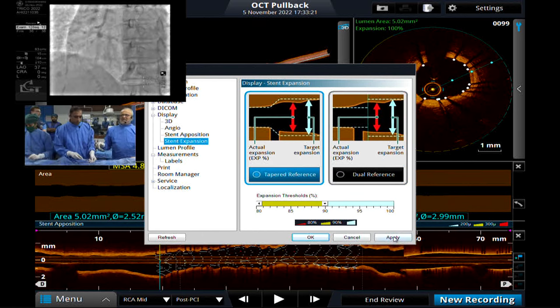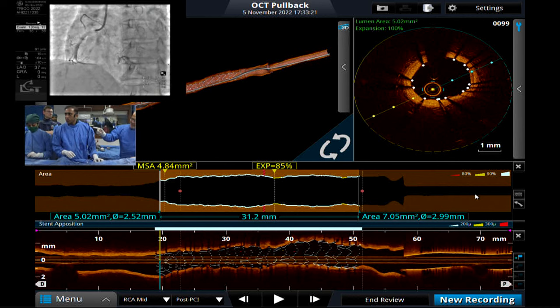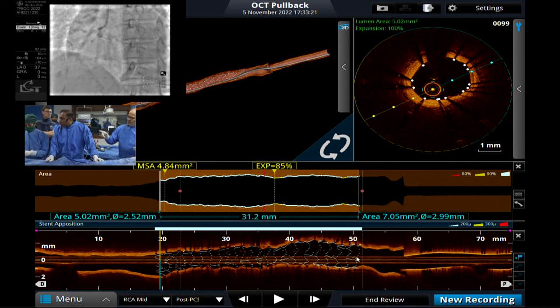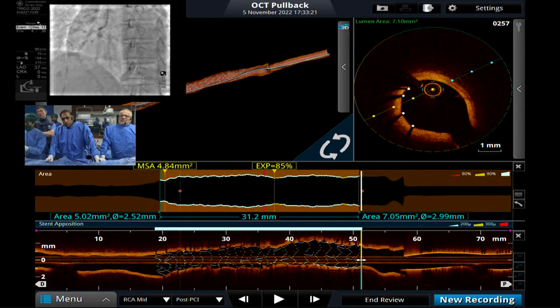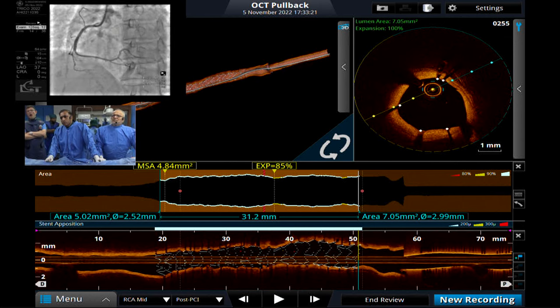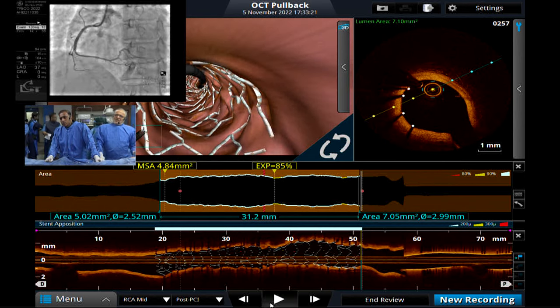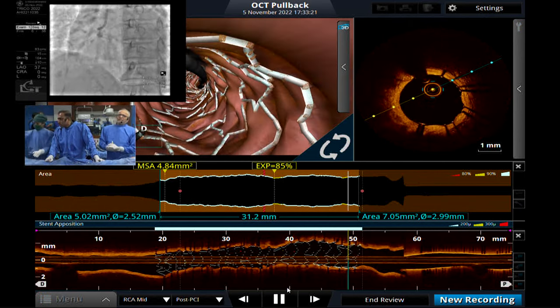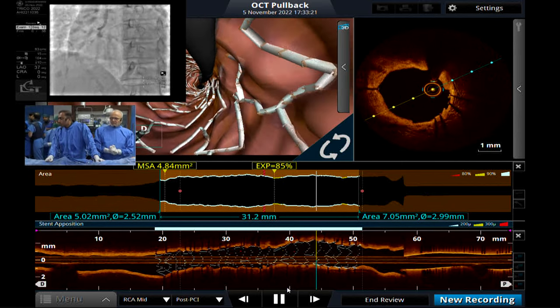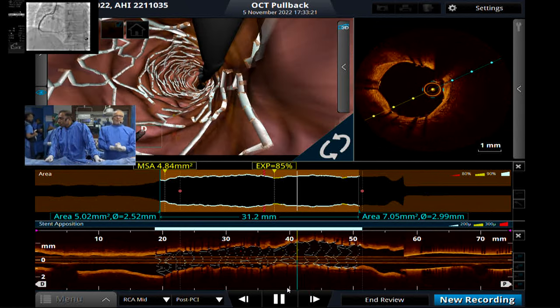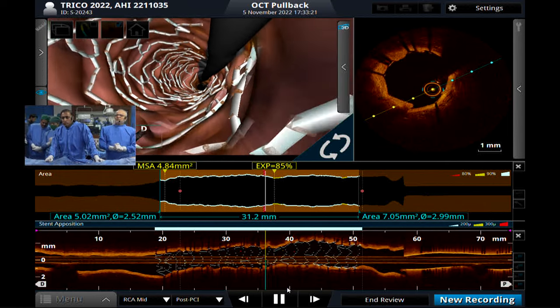Would a tapered reference have been better than dual reference for this case? Yes — for cases with LAD and a big side branch, dividing into two parts makes sense. The right coronary artery just tapers smoothly with very small branches, so the previous tapering software is very suitable here.